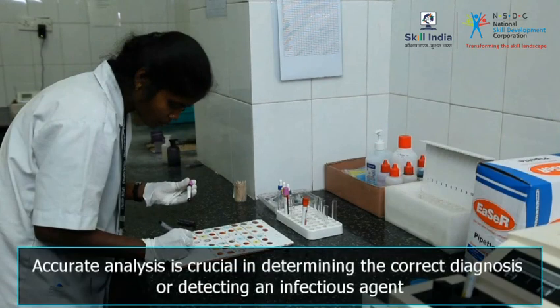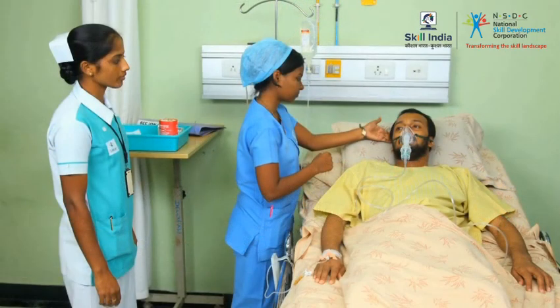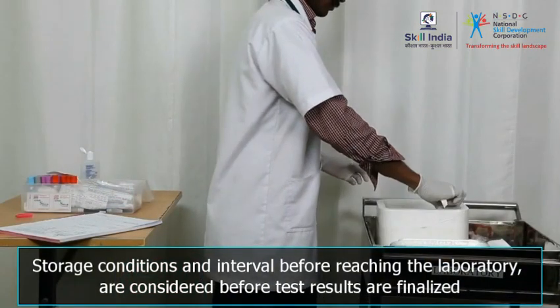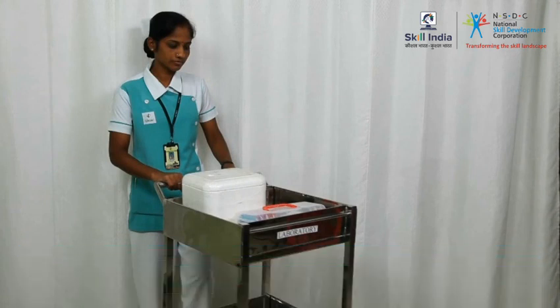Accurate analysis is crucial in determining the correct diagnosis or detecting an infectious agent so that appropriate and timely treatment can be commenced. Factors such as the correct collection technique, storage conditions, and interval before reaching the laboratory, supporting information and patient details are taken into consideration before the test results are finalized.